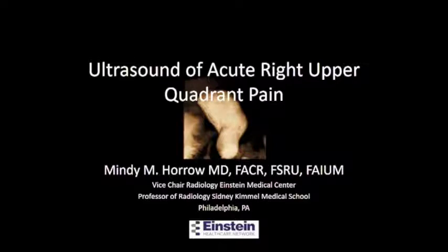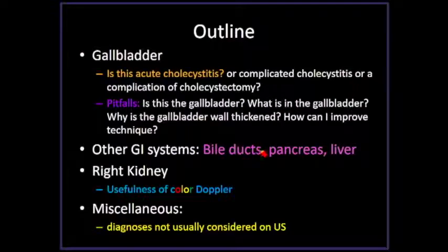I'm glad to see you all this morning for topics which sort of seem like this is us, ultrasound, and what more could we possibly say? But it is my pleasure today to speak to you about the gallbladder. This is the outline of what I'm going to talk about: a bit on whether this is or is not cholecystitis, and then some pitfalls.